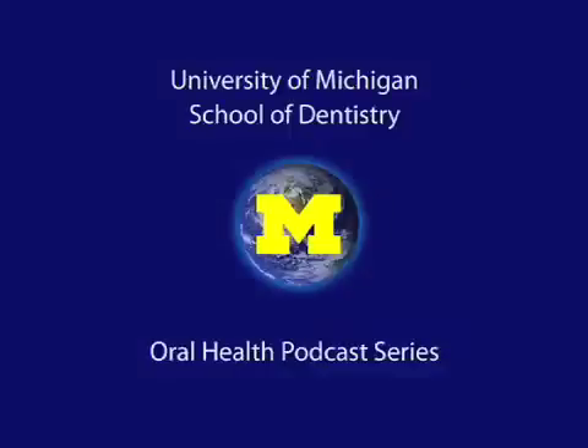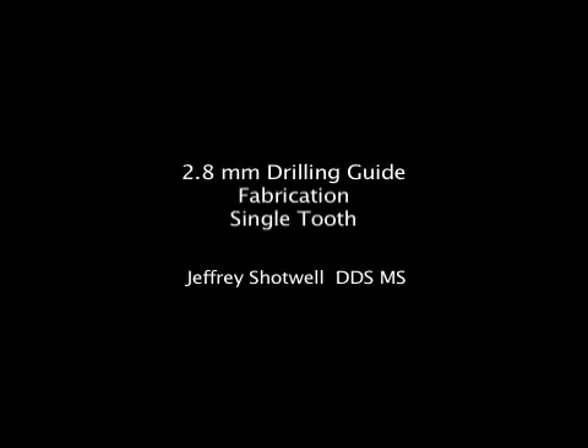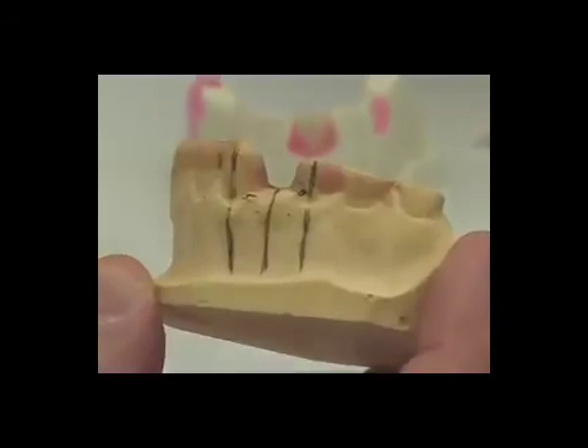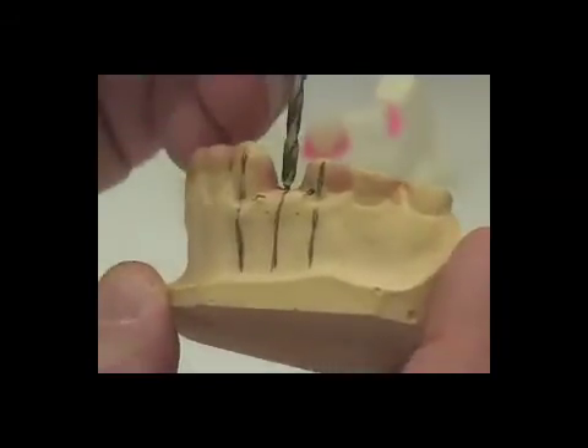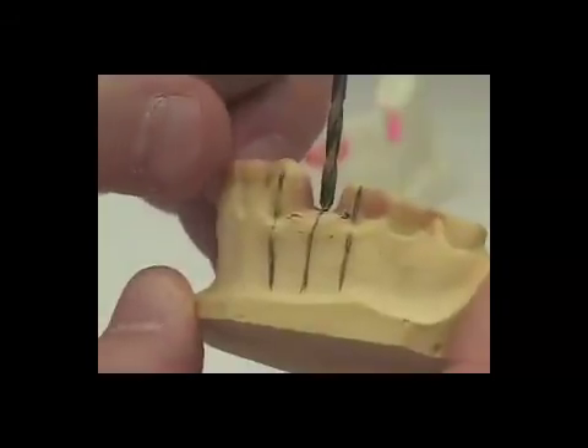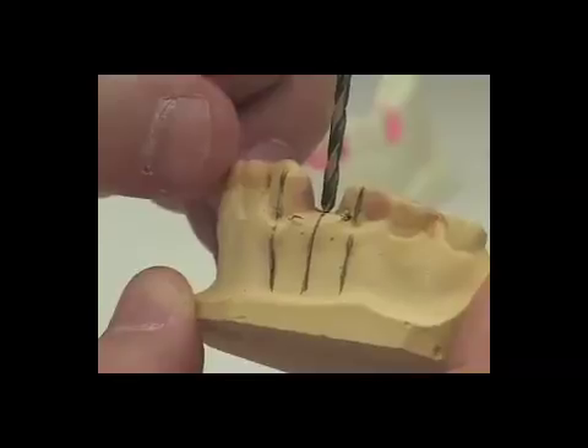Welcome to the University of Michigan Dentistry Podcast Series, promoting oral health care worldwide. We will now be taking our cast and using the next size of a drill, the 2.8 millimeter drill and the drill press, to drill our next hole for the next surgical guide.